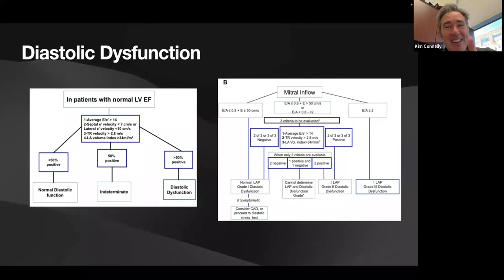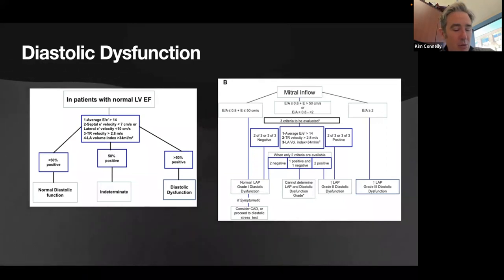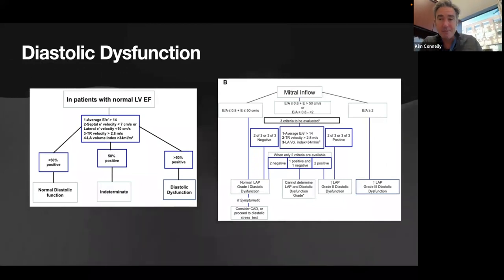And it is fun, there's no doubt about that. Just to comment about tau, one of the big issues we've always struggled with is the load dependence of all the parameters, and it is something we still struggle with. Tau was originally described as a load independent parameter. It is actually load dependent. It does vary with heart rate, as well as probably preload and afterload. And there are different ways you can measure it.